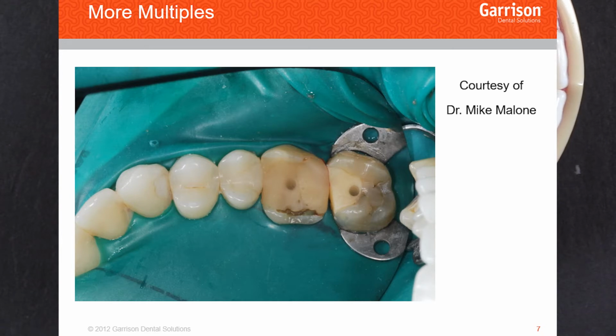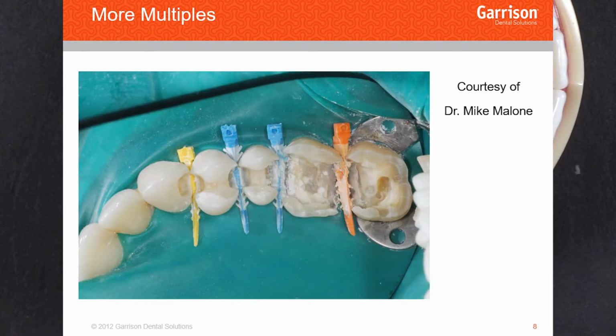method of doing back-to-backs and multiple tooth restorations. Now again, this just came in today. I have not been able to ask him why he placed the wedges before he cut the preps. I could only guess that maybe it was to basically ligate the rubber dam and hold the rubber dam down while he was doing that.